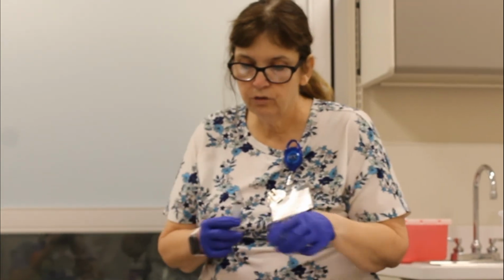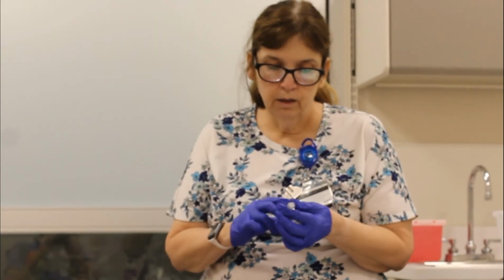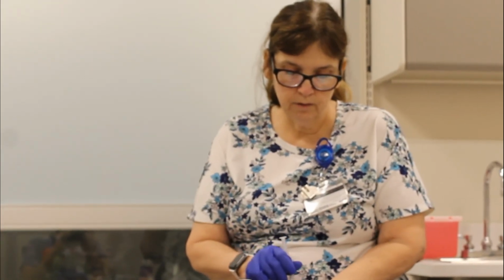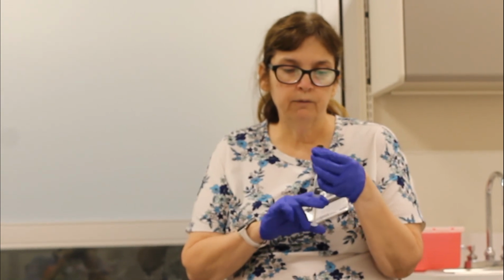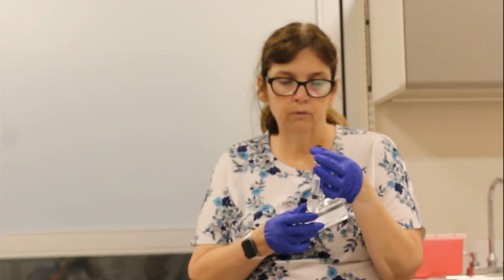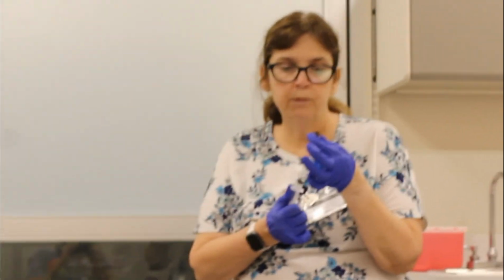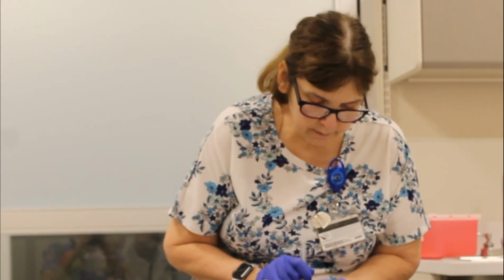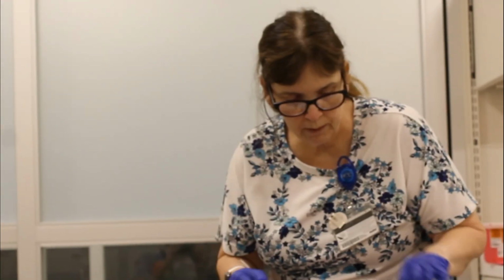Just beware, don't use this type of needle in the insulin syringe, in the insulin dosing, because it's a multi-use vial and it would create too large of a hole. So what I know about the furosemide is that I can give this at a rate of 10 milligrams per 30 seconds. All right, and so my furosemide is drawn up.